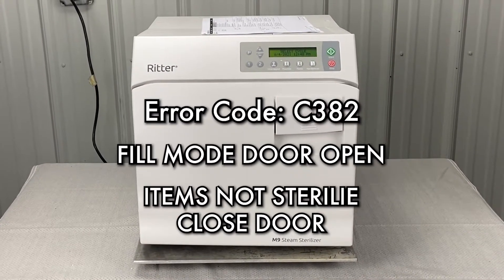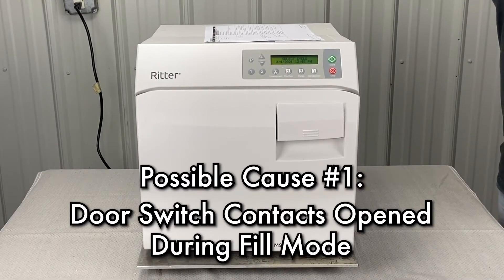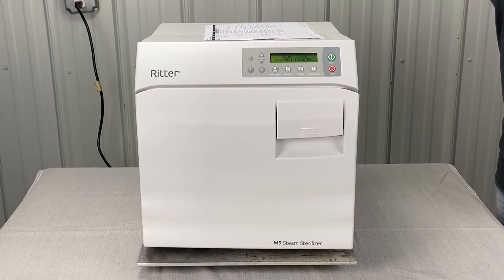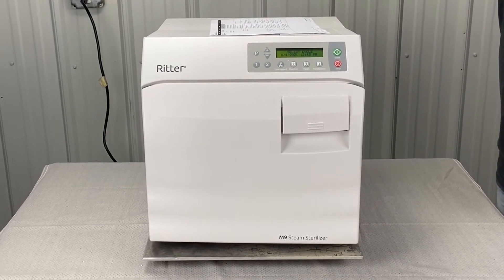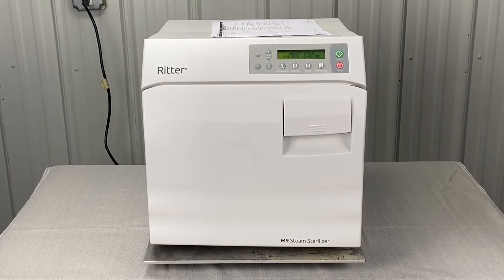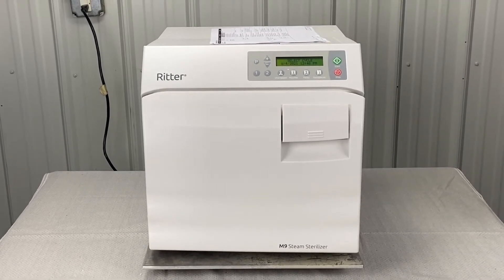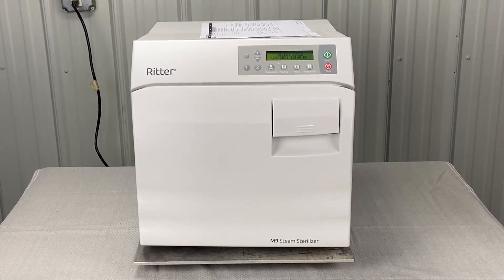Fill mode door open. We're going to start with the door switch — door switch contacts open during fill mode. Check with the operator to determine if the door was opened during fill mode. Only you know the answer to that question. If you opened the door during fill mode, this is your error. Hit the stop button, reset it, and run another cycle.